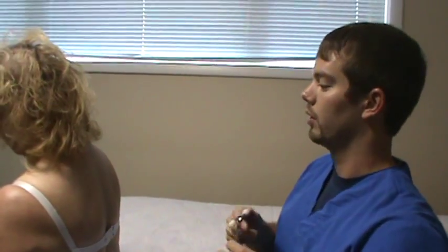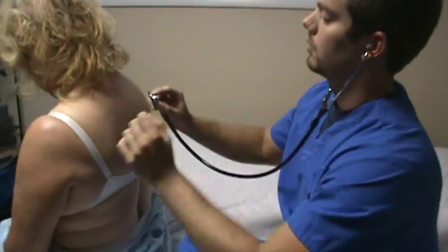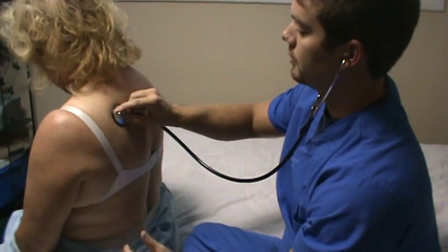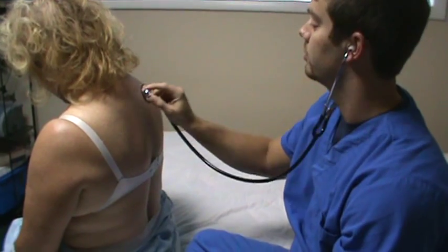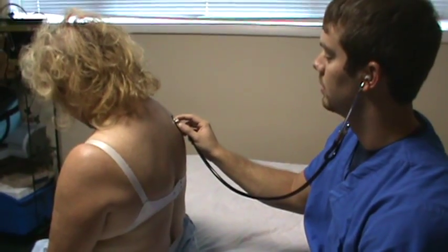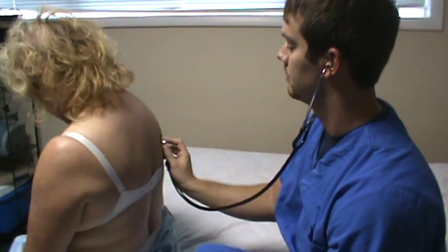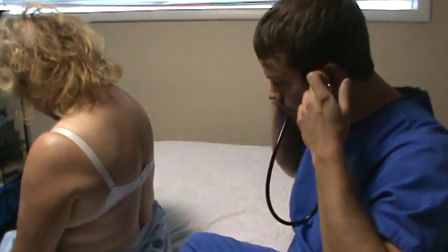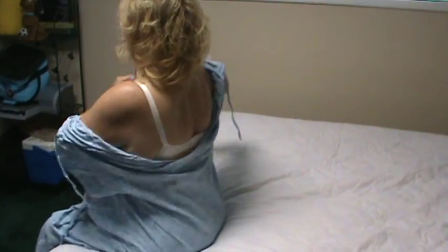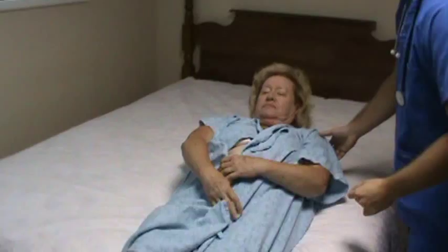Okay, and next we're going to listen to the lungs. Okay, if I can get you to take a deep breath for me. We do the same thing. We go side to side to get a good comparison of each lung. Then down. Alright, if I can get you to lay on your back. That's good.